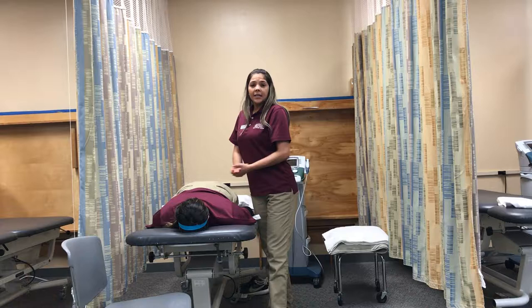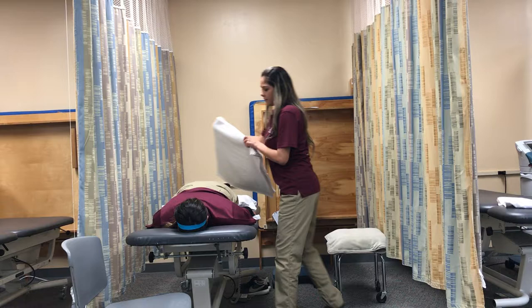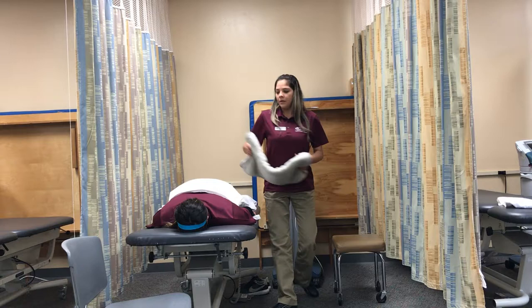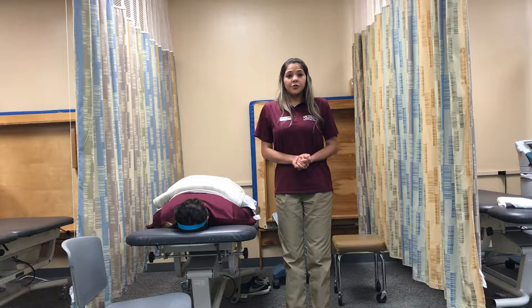Okay, between the skin and the hot pack, I will put six to eight layers of towels to avoid burning. Monica, you have to feel comfortable, not too hot, okay? Please let me know if you feel too hot.